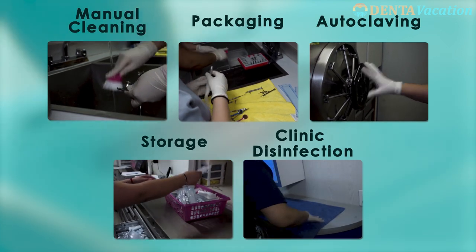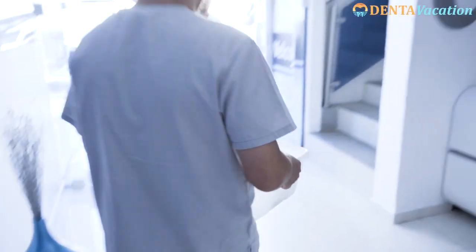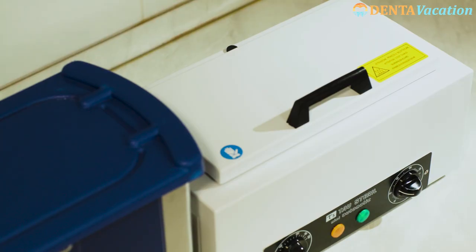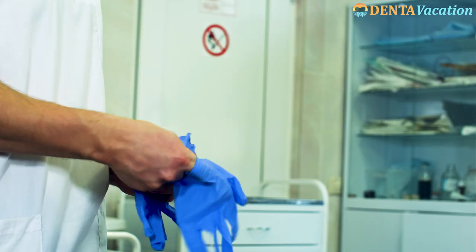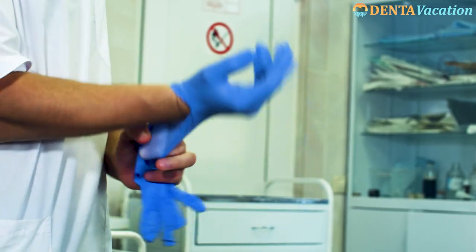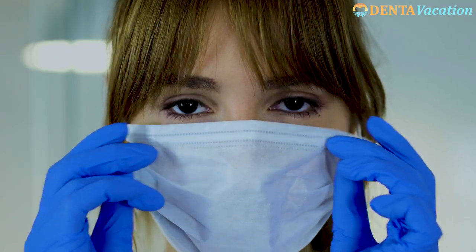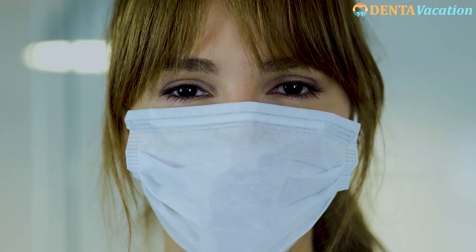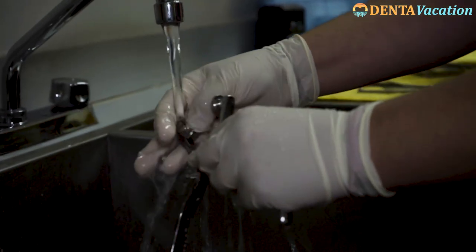The instruments are first taken to a room designated for sterilization in leak-proof tubs. The cleaning staff always wears appropriate personal protective equipment like masks and gloves. The instruments are then scrubbed manually under running water.